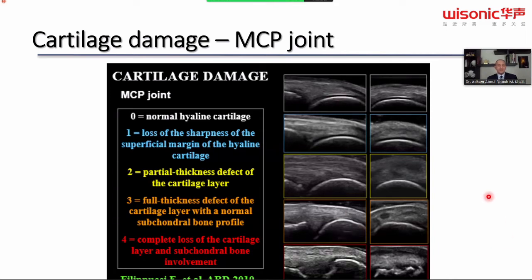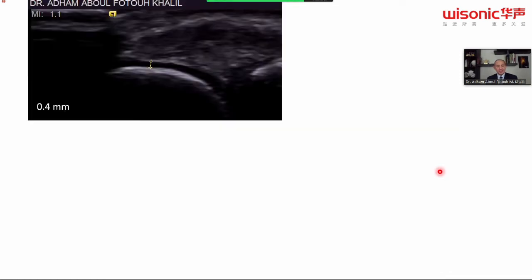As you know, the Italian group are very peculiar in working with ultrasound on the cartilage. My mentor and professor, Walter Grassi, studies only the cartilage in the hand. And it's funny when he says, I only study the second MCP joint cartilage. So it's a gradual thinning process that involves cartilage destruction.